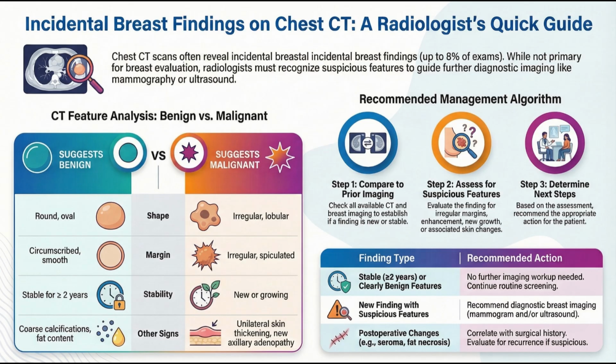And we also look at whether it's behind the muscle, retropectoral, or in front of it. The big fear with implants is always rupture. How does that look on CT? Well, a saline rupture is usually obvious. The implant just collapses. You don't need a CT. But silicone is different. Silicone is more subtle.